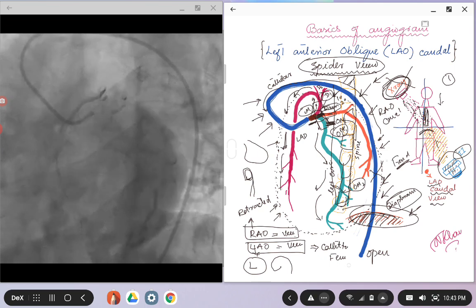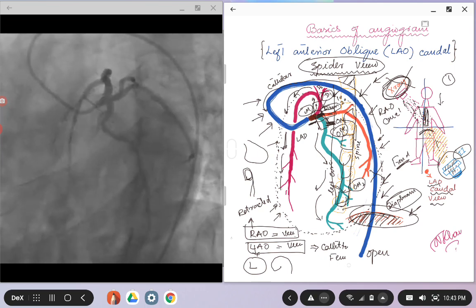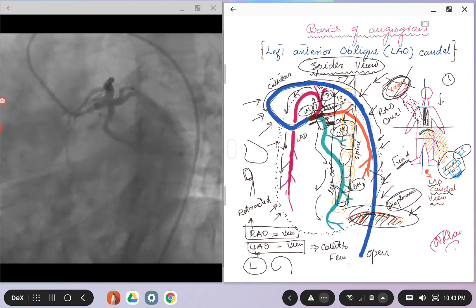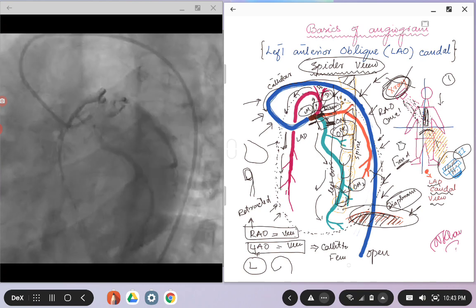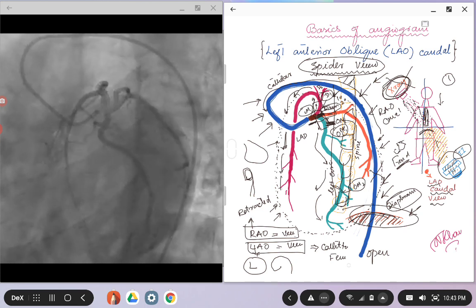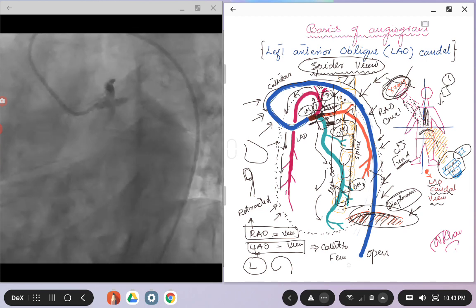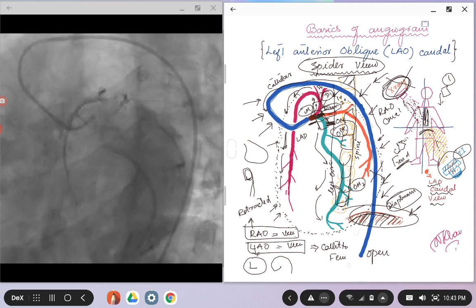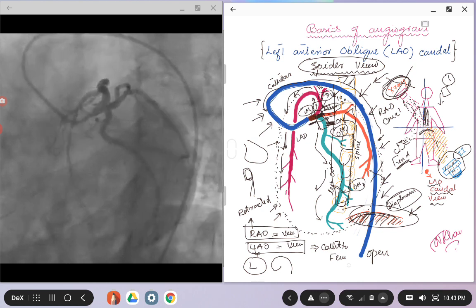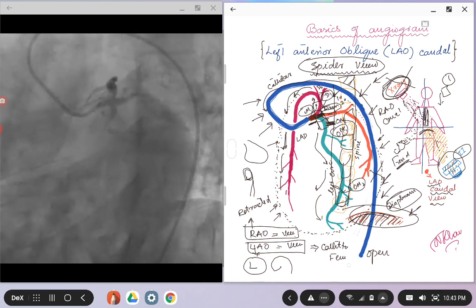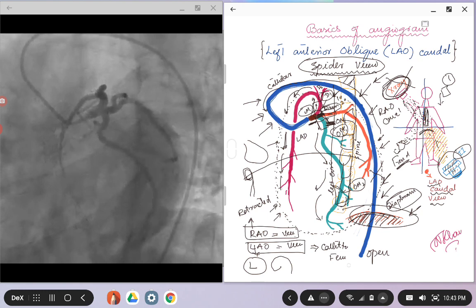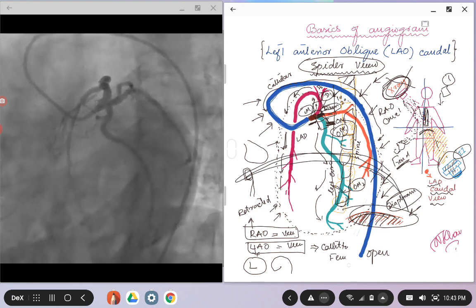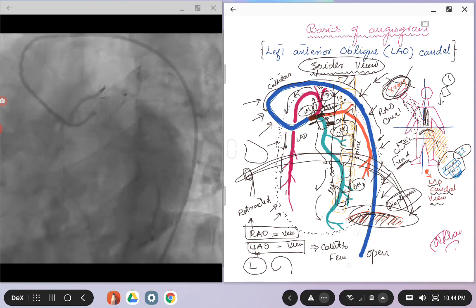But in the cranial views, when the x-ray will be in the caudal position and the image intensifier is in the cranial position, the beam, the x-ray beam that will come from below the patient, will transverse the diaphragm first and then the heart. And you might see a diaphragm something like that. And again, as I said, we will come to that when we will be talking about the other views.